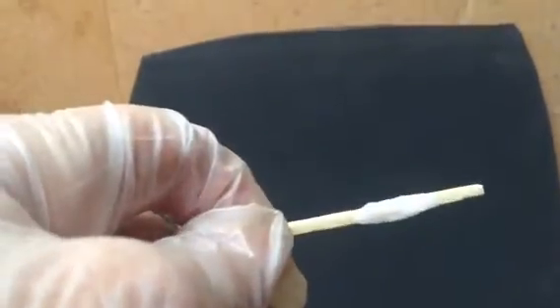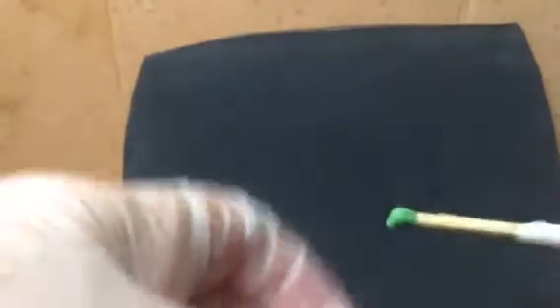It can be used for very small bones. This is a matchstick, three millimeters in diameter, that I broke and repaired, as you can see.